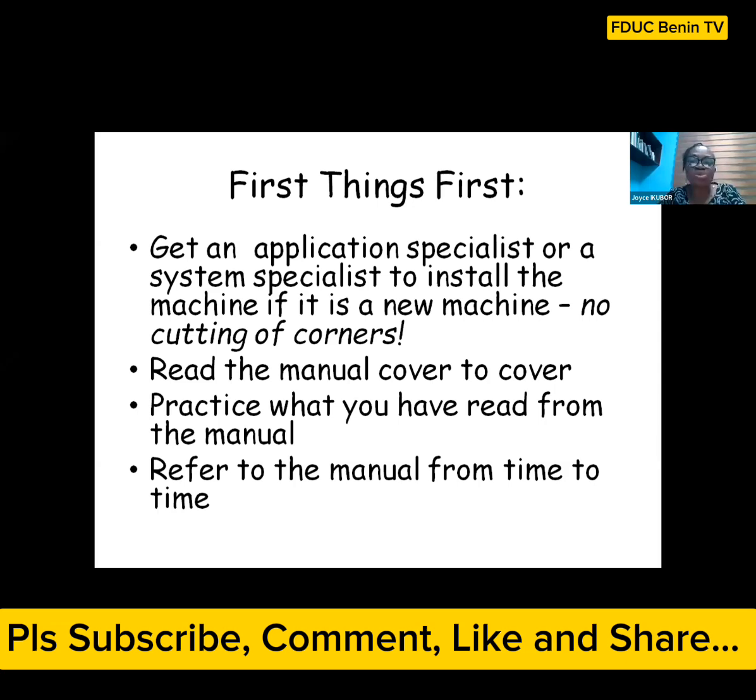Just like getting a new car, or any new machine, you need to know how to use it. If not, you may even end up damaging it. So there's no cutting of corners here. If it's a new machine, get an application specialist from the company that sells the machine to help you make sure that it is properly installed.